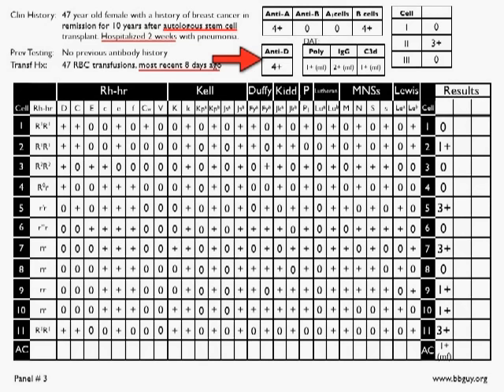The DAT, which I've thrown in here, shows some interesting findings. With polyspecific reagent, we have a 1+ MF. It doesn't stand for that. It stands for mixed field. So you have a 1+ reaction with polyspecific, 2+, a little stronger reaction with IgG, and a little bit with C3D. That shows that this particular person's sample, when pulled from the body, is already coated with both IgG and complement, and that's an important fact that we'll talk about in just a moment.